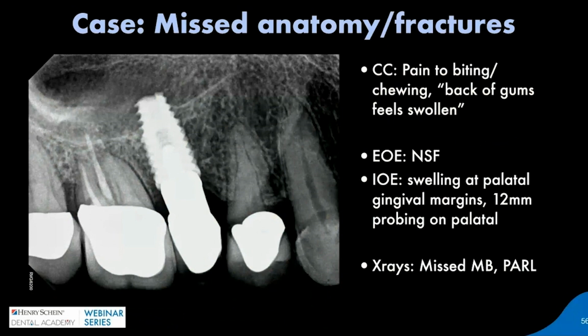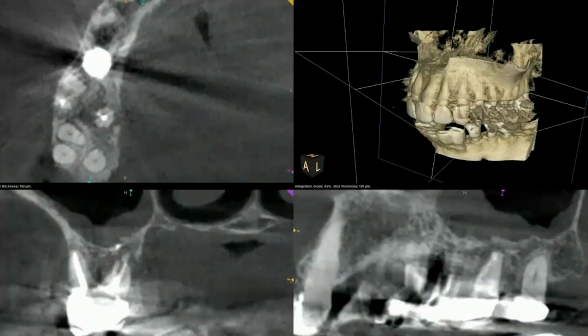But one of the reasons why we took a CBCT was to evaluate that bone loss and to evaluate what's going on in the mesiobuccal. So in this case, we can see that there is no root canal filling material in the mesiobuccal. What I'm trying to look for is whether or not that mesiobuccal root can even be treated. Was there just missed anatomy? Is it excessively calcified? Did the previous operator possibly ledge or cause some sort of issue that's not visible from the 2D radiograph?